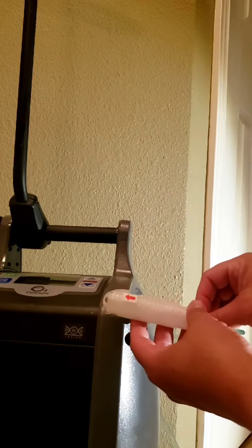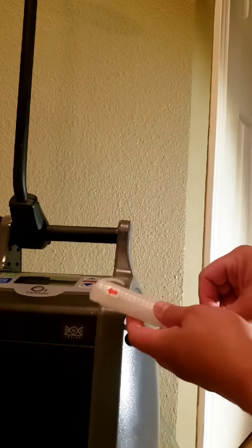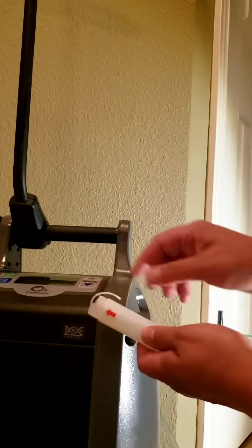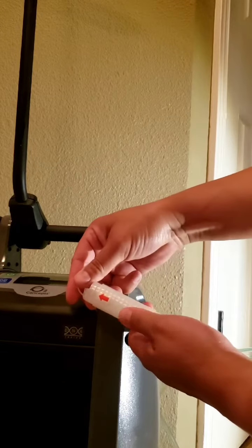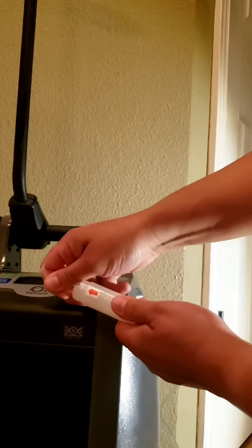So once you have your tubing where you want it, you're going to go ahead, hold your tubing in place, and you're just going to pull the tail.